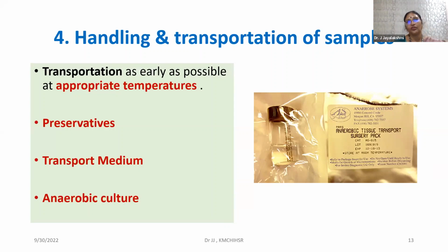So you have to be very careful. What is it that you are transporting? How is it going to contaminate other samples that you carry along with it? How do you need to pack the sample so there is safety of the person concerned as well as through the transportation process? So this is again something that needs to be considered when packing and transporting samples, either within the laboratory from the phlebotomy area to the processing area, or from another center to the receiving laboratory, or passing on to a different location or even a different country if you need to. So it has to be transported appropriately.